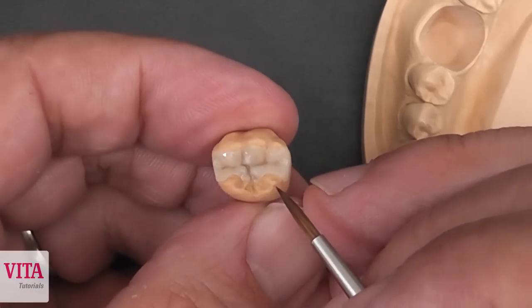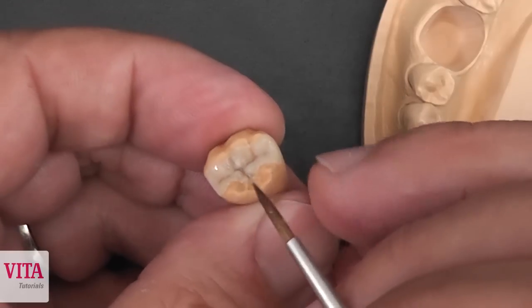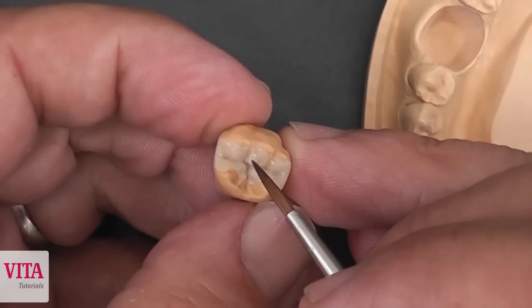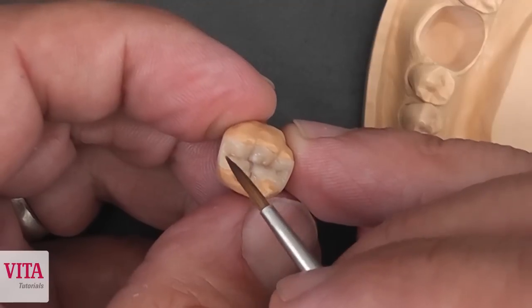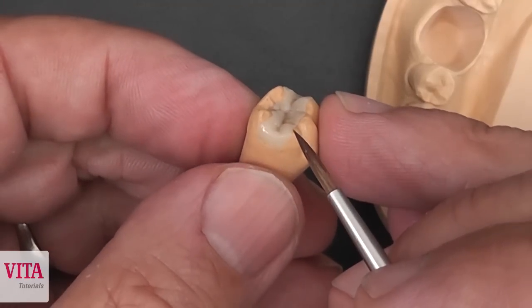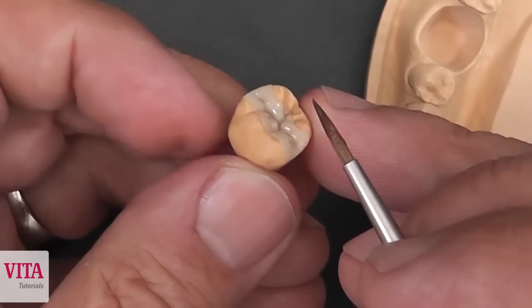Here we now see the final result after grinding, polishing, and ultrasonic treatment. We can see the small details like the EE-1 effect, a light stained fissure, and a perfect margin area from this Vita VMLC flow composite inlay.